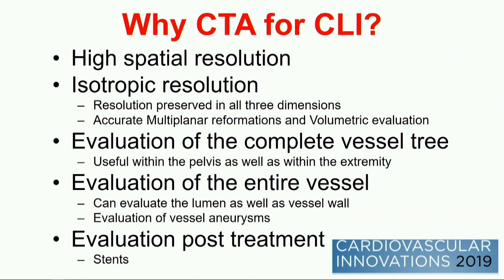What do I like about CTA? So the modality of CTA itself. A lot of people get CTAs because it's easy, it's accessible, it's everywhere in every ER. You can just say, let's get a CTA. Well, it gives you high spatial resolution, and that allows us, a big radiology term is isotropic.